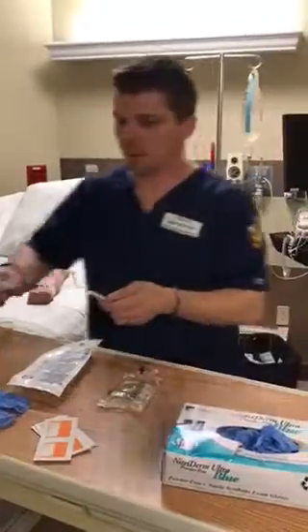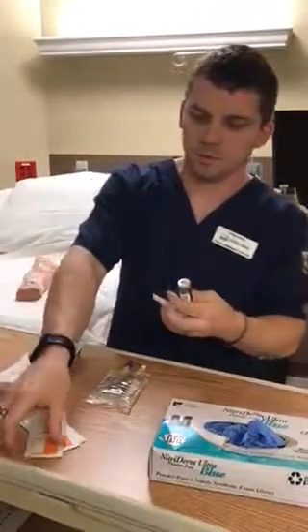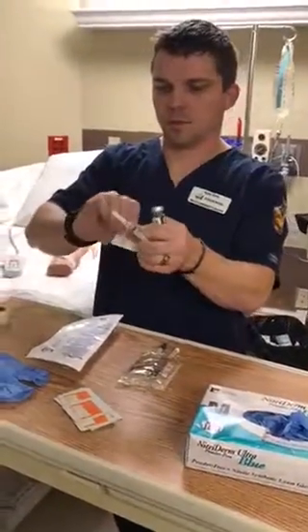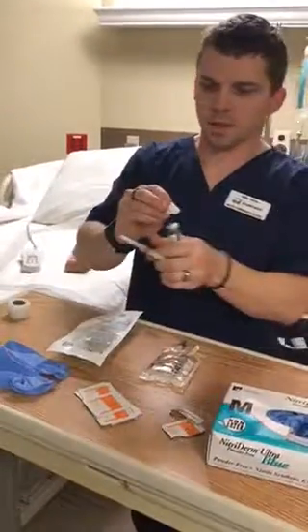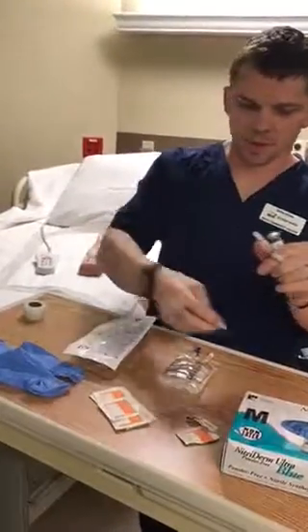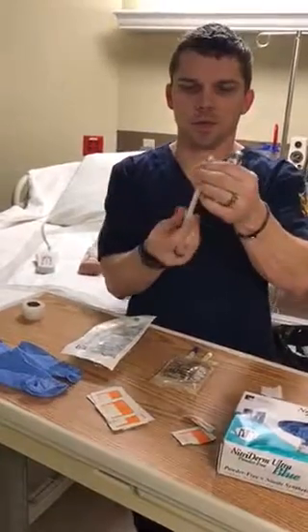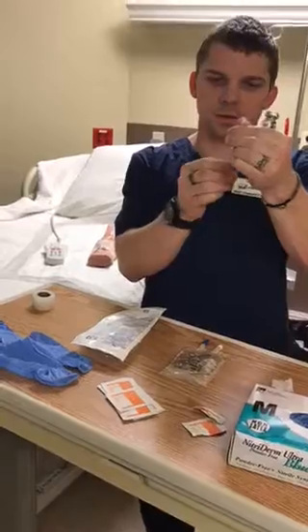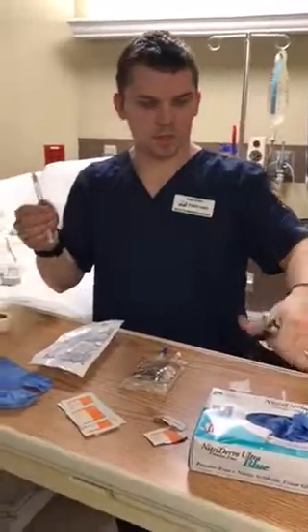I'm going to go ahead and throw the cap over there, and I'm going to open my alcohol swab. Set that there. I'm going to scrub the top here, let it dry. I'm going to set my alcohol swab as a clean location in case I need to set anything down. I'm going to pull up 3 milliliters of air. I'm going to remove the cap and set the cap right there.